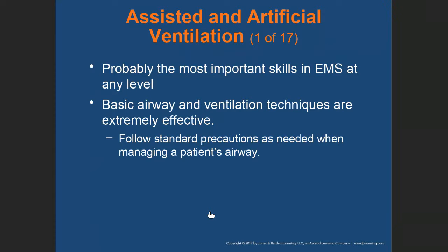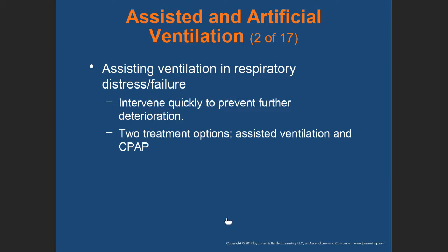Basic airway and ventilation techniques are extremely effective if done properly. Follow standard precautions as needed when managing a patient's airway. So let's look at our devices. We assist ventilation in respiratory distress, respiratory failure, and respiratory arrest.